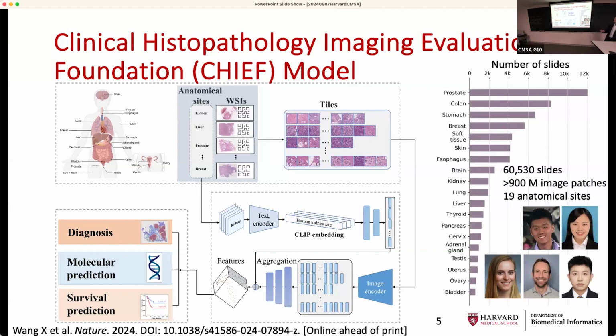And we also leverage another source of information in our multi-modality analysis. That will be the text descriptions of the same samples. So from our text descriptions, we can identify a few useful pieces of information from our pathology reports written by pathology experts. But one caveat is that not all samples are accompanied by a very detailed description of that particular human tissue. So our approach is we just take some simple description that we can reliably identify from all sources. And those are largely related to the description of where this particular sample is coming from. That is, which human organ this particular tissue came from.